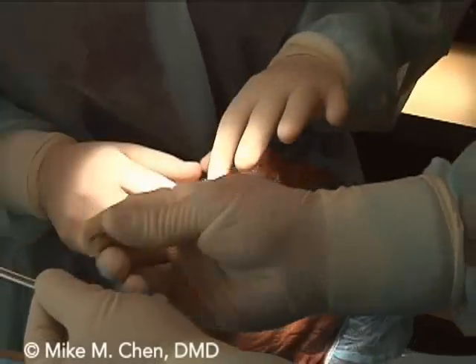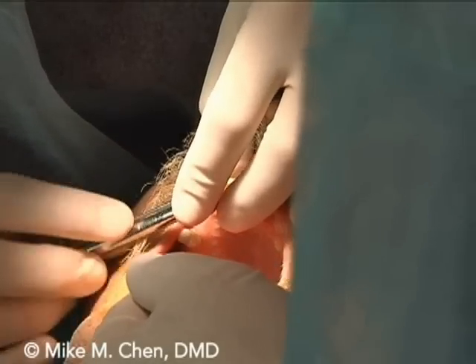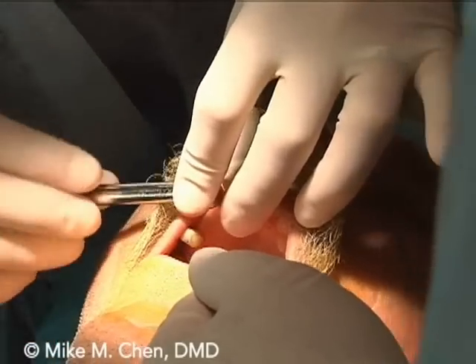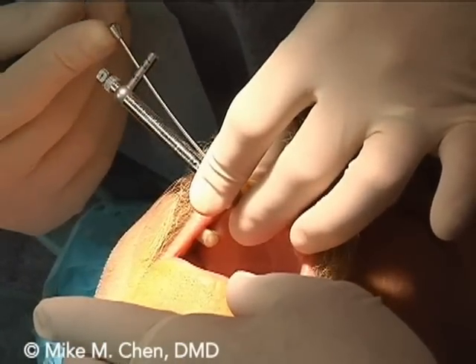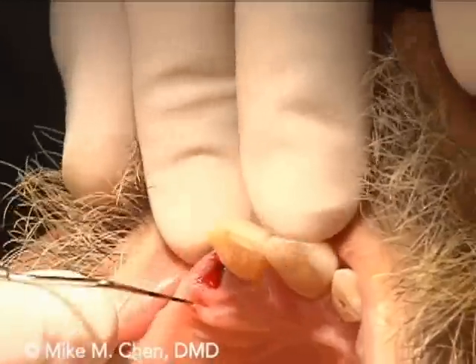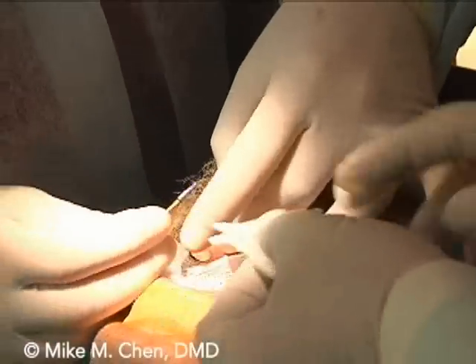Once the implant is placed, you want to torque it down, and it should engage to close to 35 Newton centimeter or more. For the most part, you should be able to achieve 35 Newton centimeter or more pretty easily. Usually it's the apical 1/3 that will engage onto the bone. And once you're able to achieve that strength, then the next step, usually in this situation, you can see there's not much bleeding. It looks good. So what we do is we take a cover screw and close up the internal chamber of the implant.